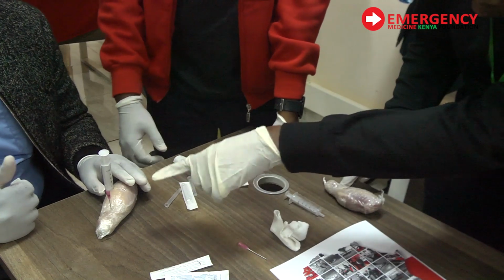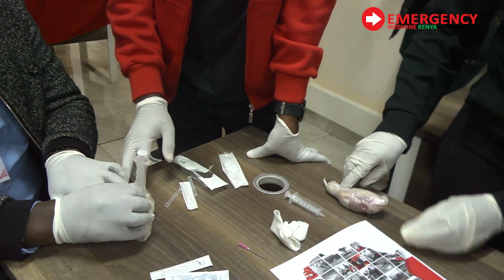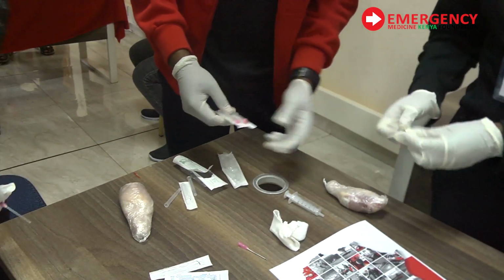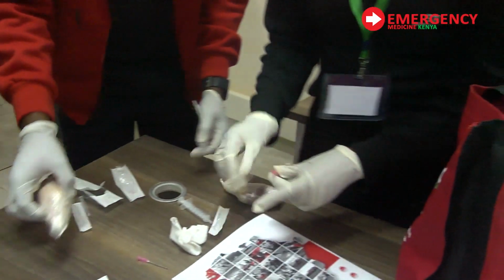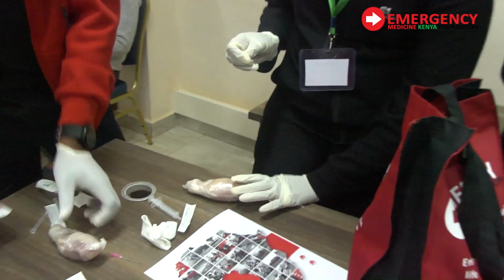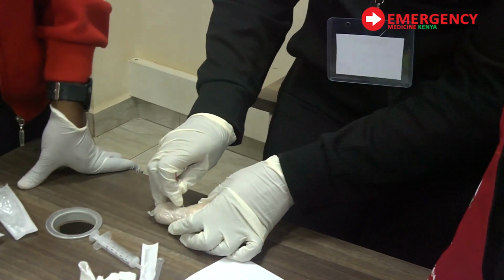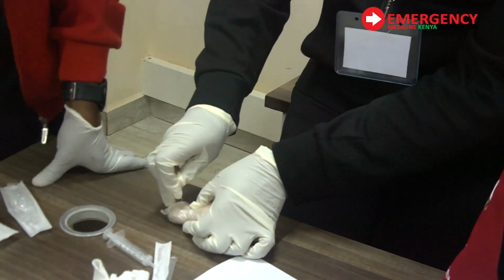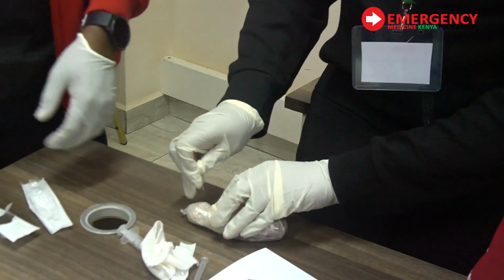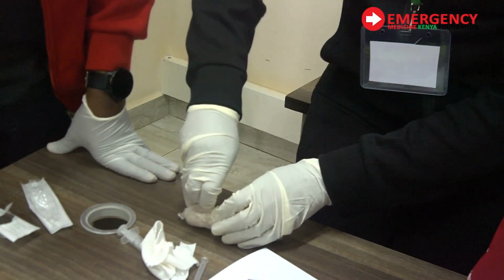But remember, the anatomy does not change. The bone is just changing shape. It's either a flat bone or a round bone. Inside the bone there will be bone marrow, before you start getting the osteocytes, and before you come and get the periosteum. Whether it's a flat bone, like the sternum, it can still go. For the sternum, the landmark is just at the manubrium. The manubrium, so there is the first part.